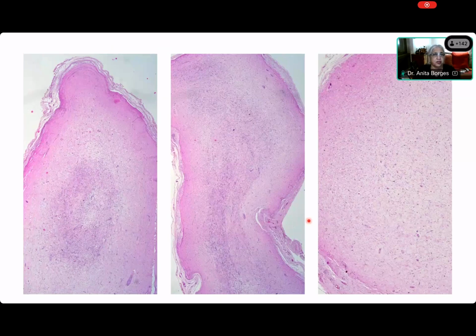Now what are you seeing here? You've seen all these sections. Ma'am, what do you see? Ma'am, I can see spindle cells. Spindle cells. You can't see any spindle cells at this magnification. Okay, no. What are you seeing?